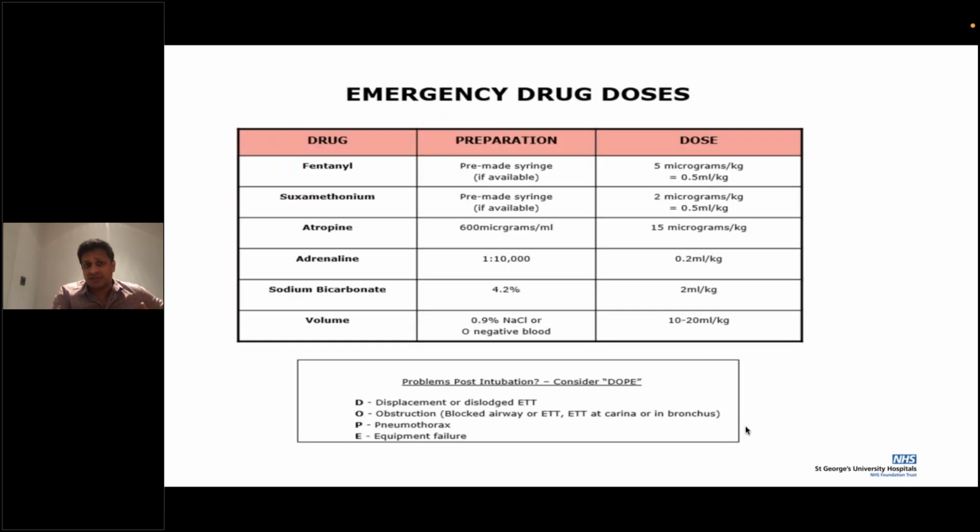At all times, if things go horribly wrong after your intubation, if there is sudden desaturation, you really ought to think about your DOPE mnemonic again. You're really talking about displacement of your endotracheal tube. It's quite common for this to happen when you're fixing it. You've got your ET tube in, everything looks good, but at the time of fixing it, it's not uncommon at all for it to be displaced, and all that hard work is gone.